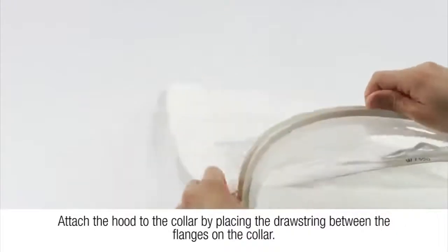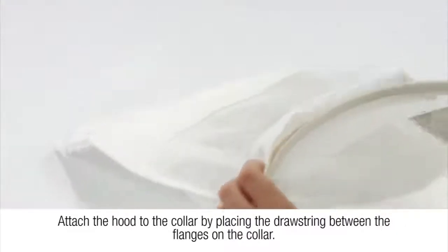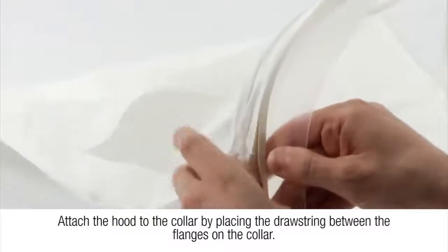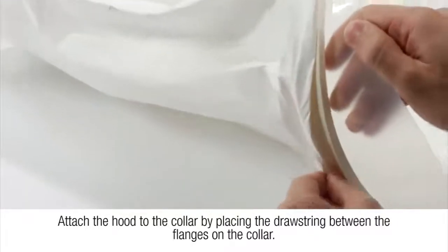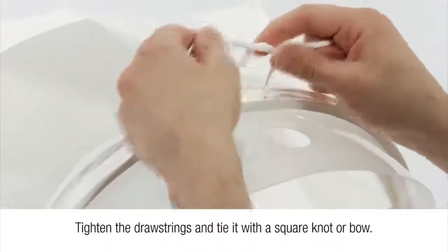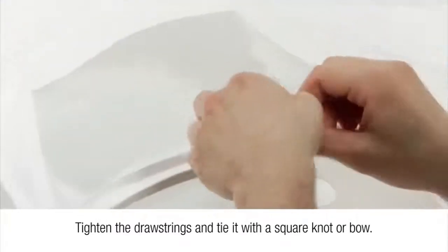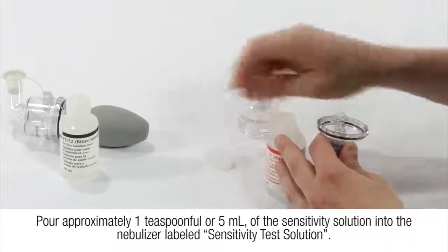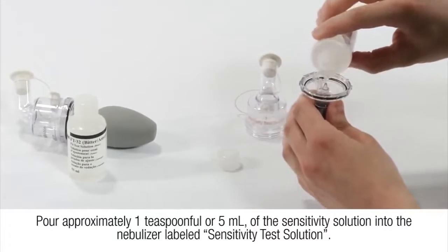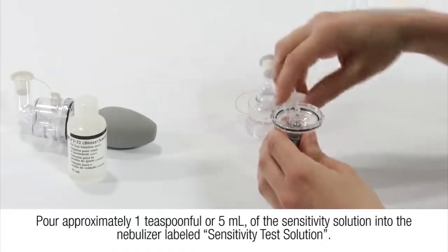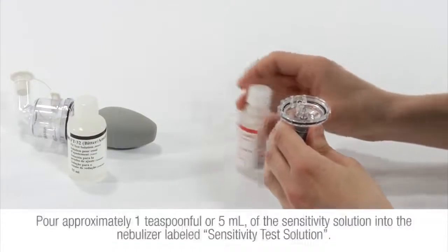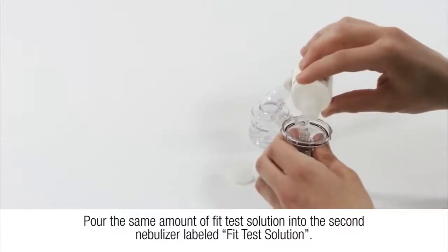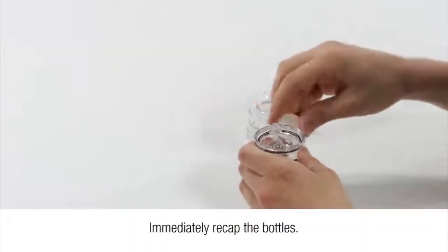To prepare the qualitative fit test apparatus, attach the hood to the collar by placing the drawstring between the flanges on the collar. Tighten the drawstrings and tie it with a square knot or bow. Pour approximately one teaspoonful or five milliliters of the sensitivity solution into the nebulizer labeled sensitivity test solution. Pour the same amount of fit test solution into the second nebulizer labeled fit test solution. Immediately recap the bottles.